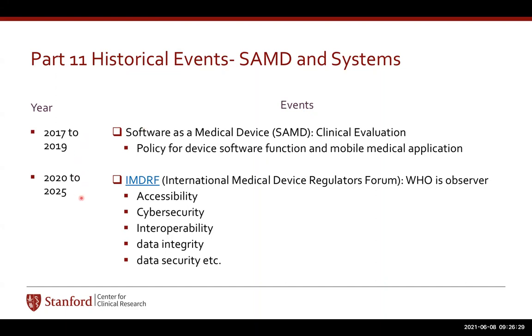But during the same time, in 2013, an organization was formed, which is IMDRF. The FDA is the chair for this, and WHO is the observer. It means that overall, they are under the WHO umbrella, and many countries all over the world are participating in this. The function of IMDRF is to set the direction for some of the things that are happening if we use software as a medical device.